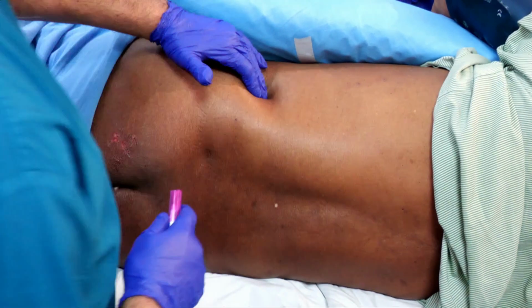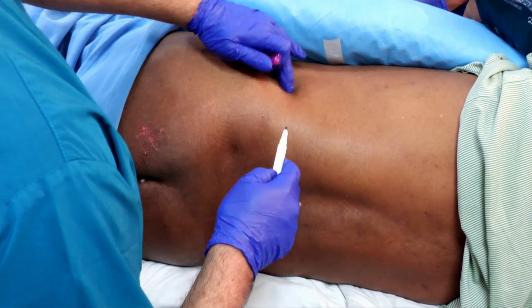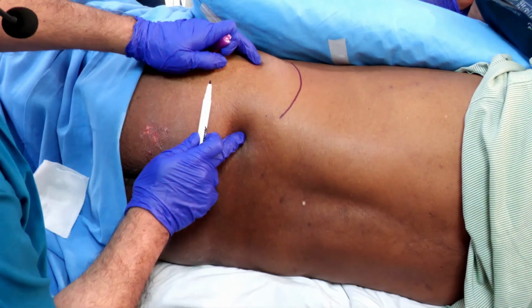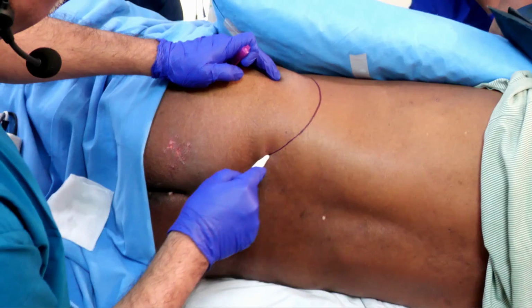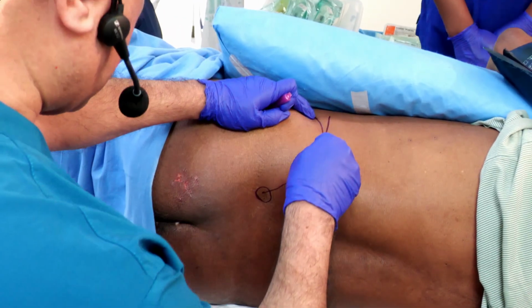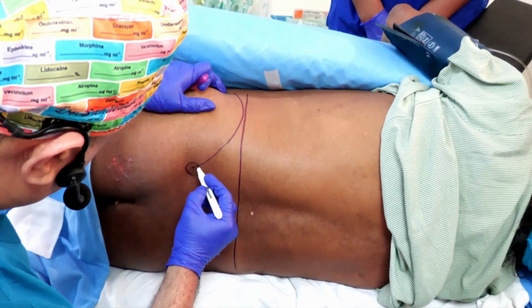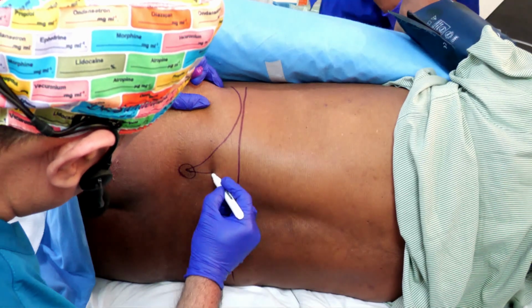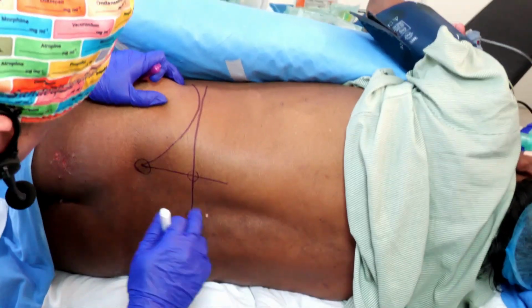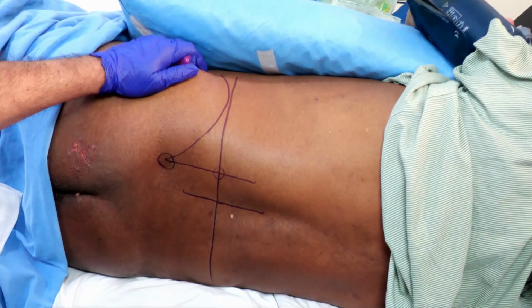So I'll just demonstrate the anatomical landmarks first. This is the highest point of the iliac crest. We chalk out the highest point of the iliac crest, and it usually ends at the level of the posterior superior iliac spine. So this would be the posterior superior iliac spine. And the highest point of the iliac crest to the other iliac crest, that would be the intercrestal line. And the line which moves cranial from this PSIS intersects at one point, and this is the point of needle insertion, which would be around 3 to 4 centimeters from the midline, that is the spinous process.